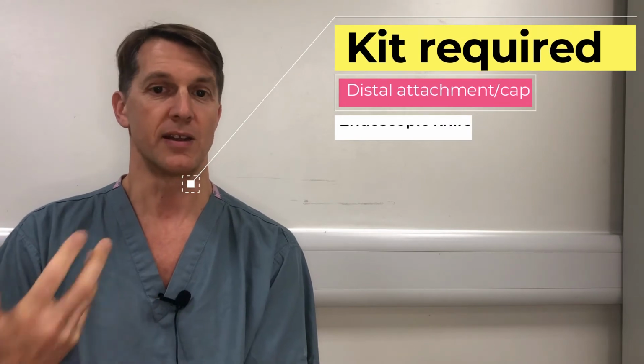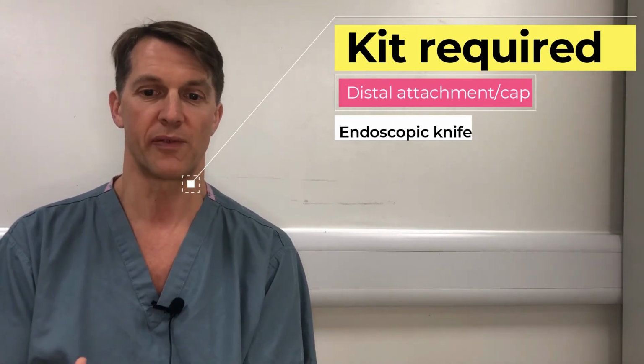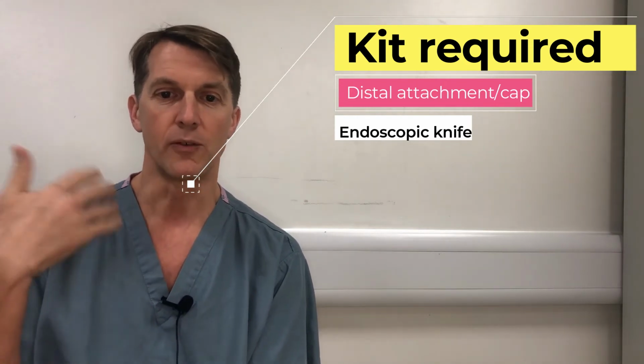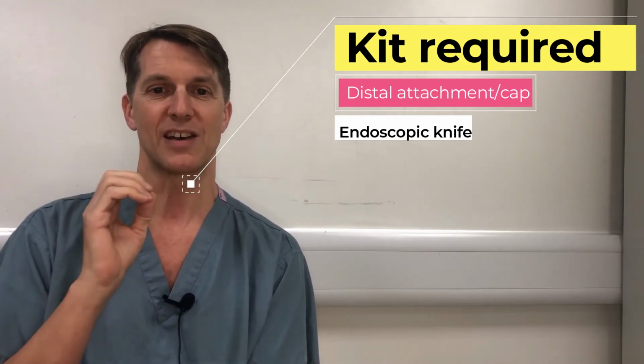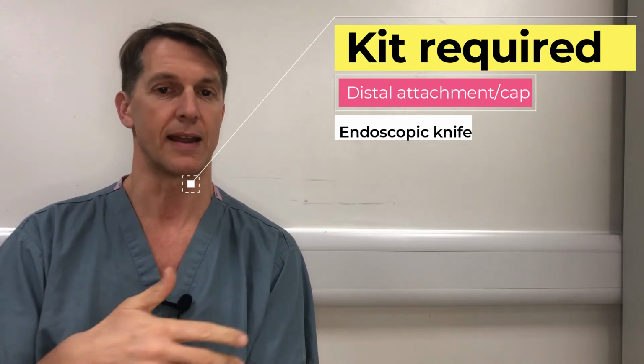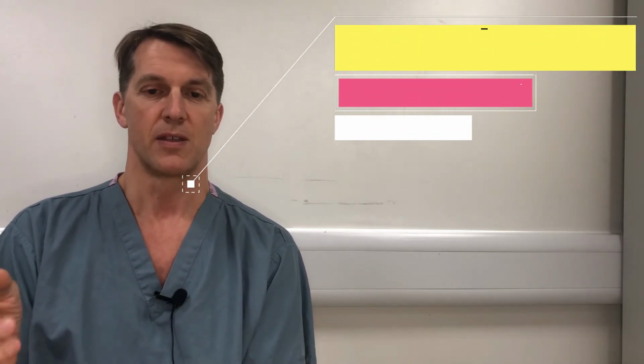Now, the kit is fairly simple. You need a cap or a distal extension on the scope, and a knife to do the cutting. My personal preference is the Erbe hybrid knife, which is a very powerful water jet that runs through the center of the knife and allows you to maintain significant submucosal elevation, and that improves your vision. The procedure involves 3 steps.